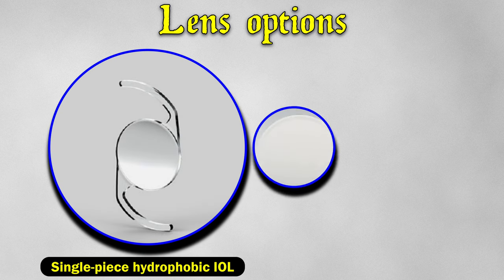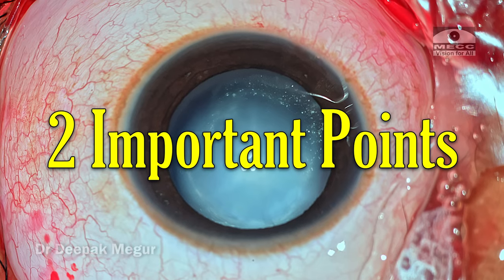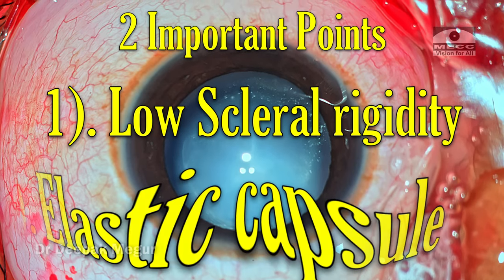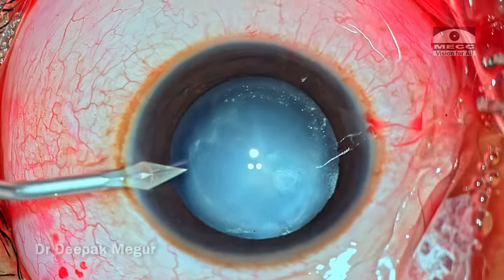The lens options I had kept ready were a single-piece hydrophobic lens as well as a multi-piece hydrophobic lens of the appropriate power in case of any adverse events. When operating on a child, two important differences to keep in mind compared to an adult eye: number one, scleral rigidity is going to be very low; number two, you are dealing with an elastic capsule.